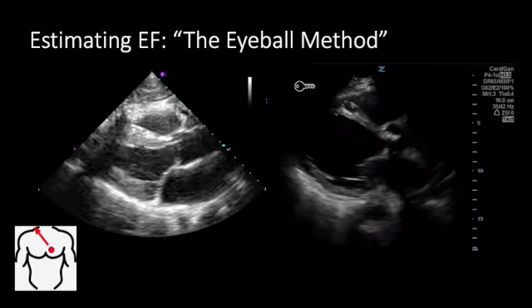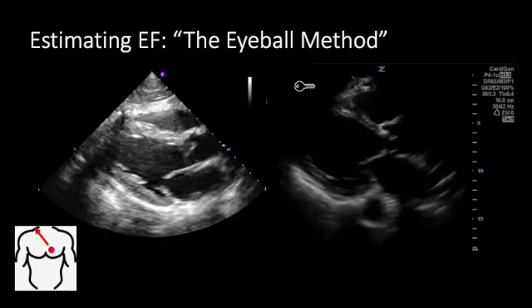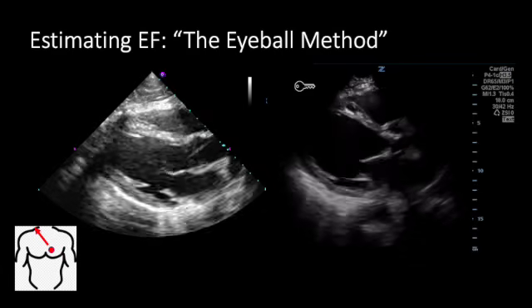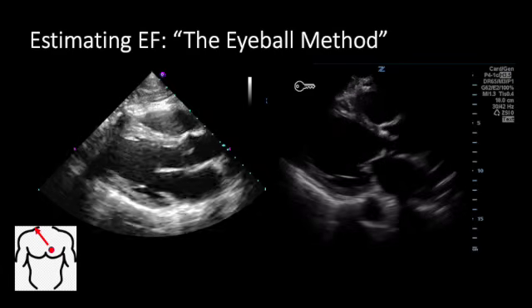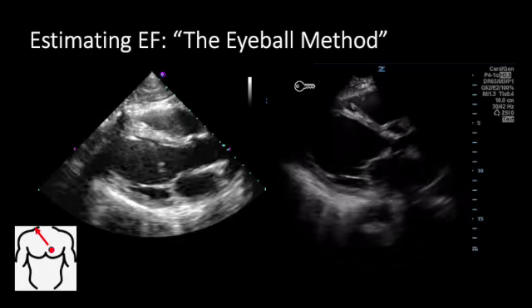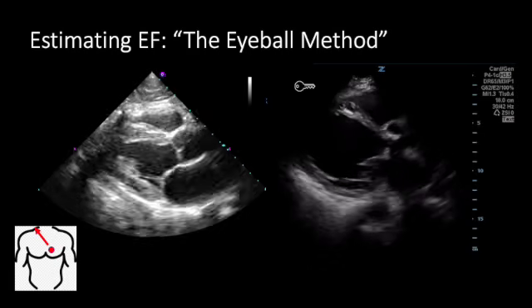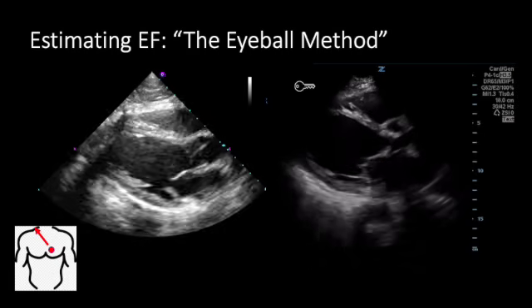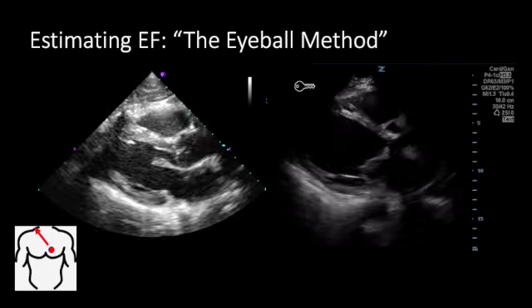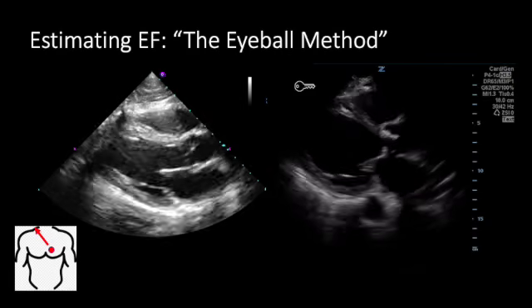Now, I think if you just look between these back and forth, you might be able to see some of those differences in the motion of the heart, in the movement of the mitral valve, and just the overall contractility that may make you feel like you have a good estimation of what the eyeball method looks like. But we do want to put a couple of parameters on our qualitative assessment to help us know and feel confident in being able to say that the ejection fraction is normal using this method.